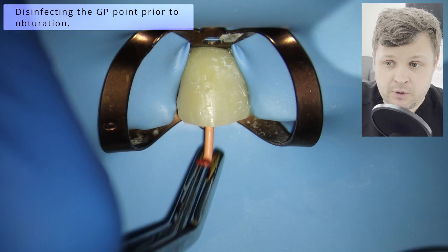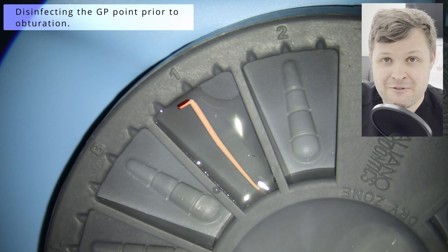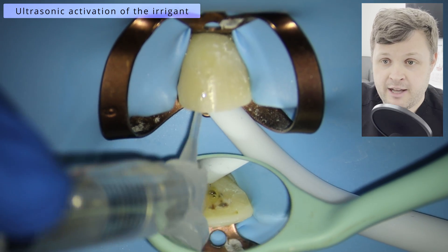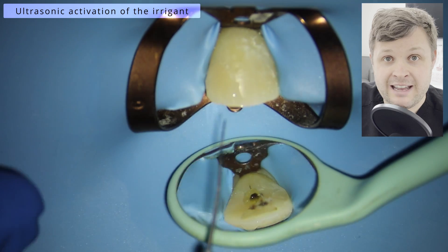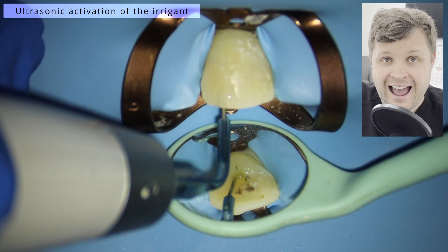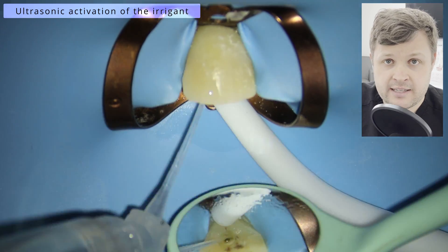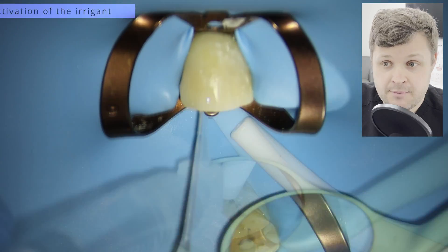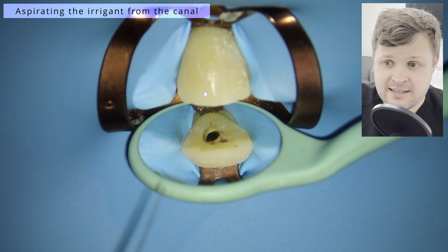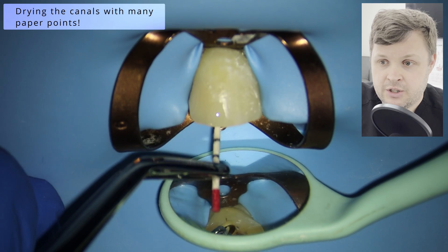We remove the GP points and place them in the Estilo Italiano disinfecting pot — make sure you disinfect your GPs, remember they're not sterile. Then we do our final irrigation protocol. I like to use ultrasonic tips to activate the irrigant and get it into nooks and crannies — lots of irrigant, lots of activation. We've got loads of time because we didn't need to shape. Then we aspirate the excess irrigant from the tooth.